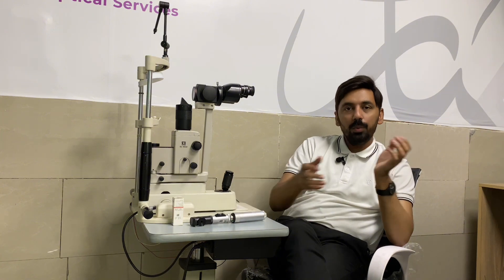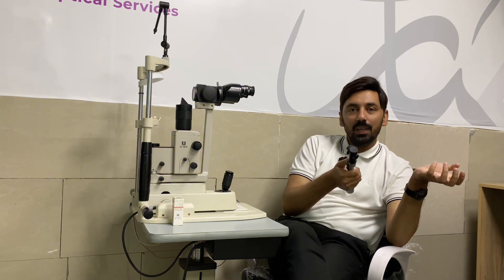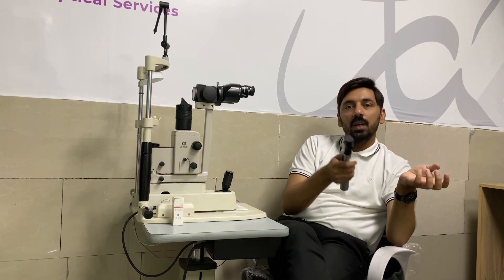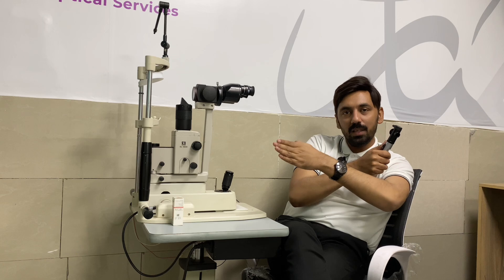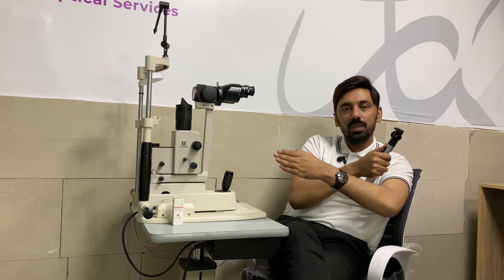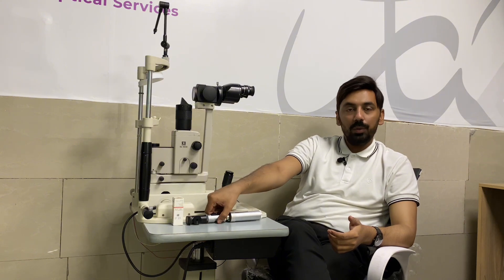With movement is when you move your streak in one direction and the reflex inside the pupil moves in the same direction. Against movement is when you move the retinoscope in one direction and the reflex inside the patient's pupil moves in the opposite direction.